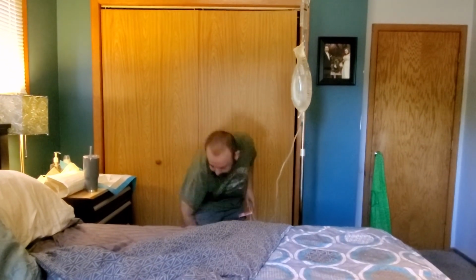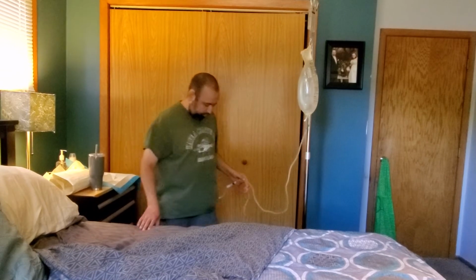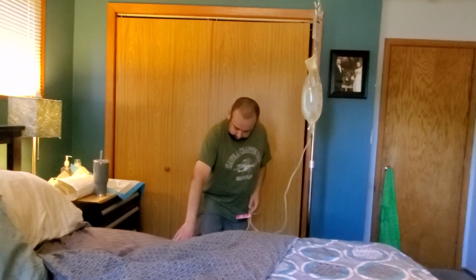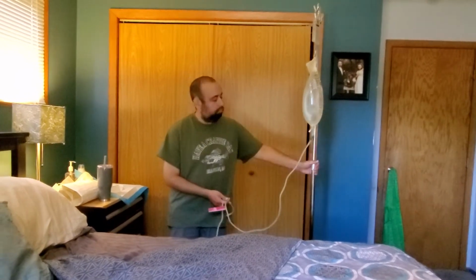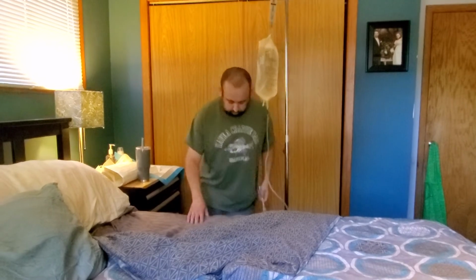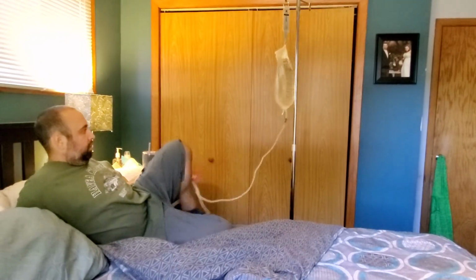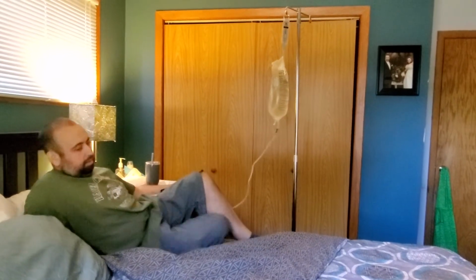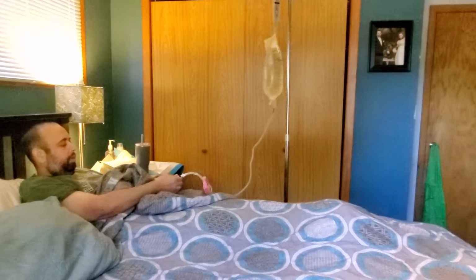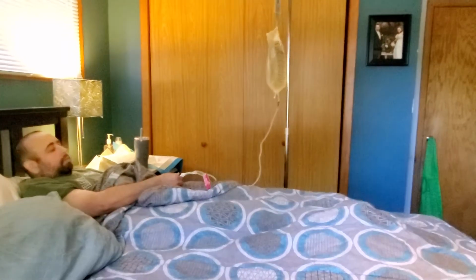So on the transfer set itself, there's what's called a roller clamp, and that's how he opens it and closes it for the solution to go in and for the draining to come out. So right now it's closed, so nothing's filling until he lays down, because that's been found to be the most comfortable for him. Yep, laying flat tends to work the best for me. So once I get untangled, lay down, and I can open the roller clamp, which is this white piece here, and just start out slow and let it start filling my abdomen.